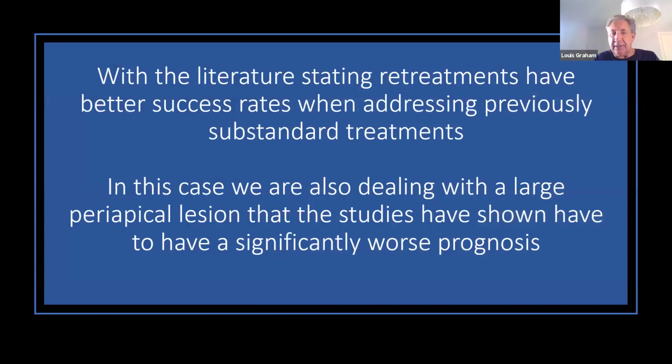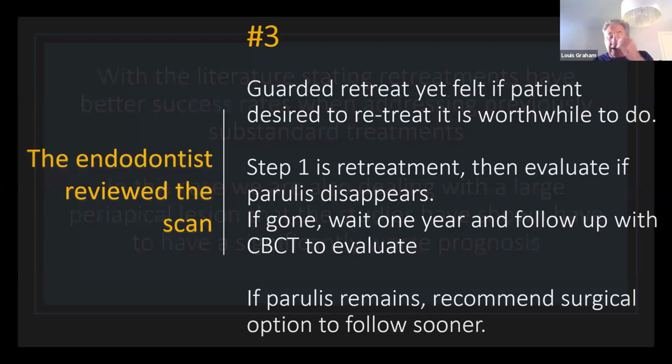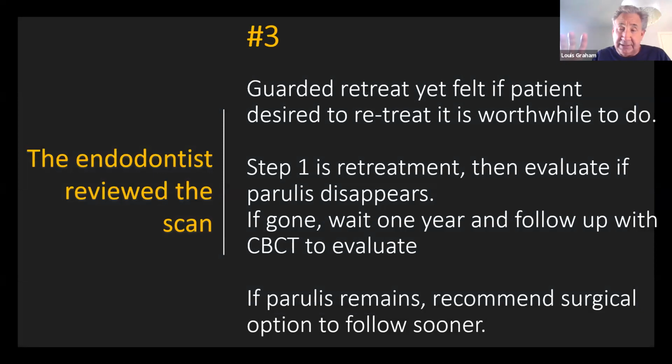The literature states you have better success rates when retreating previously substandard treatments. Well, this was substandard. Short fill on MB1, and MB2 was never found. But on the other hand, you have a worse prognosis when the lesion is as big as this. So I just sent my endodontist a copy and said, take a look at this. My patient doesn't have to go see her. And she said it's a guarded retreat, but if the patient wants to try it, let's try it.